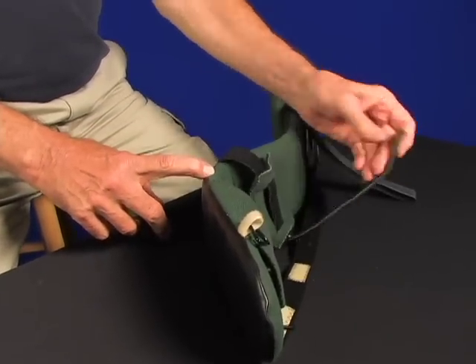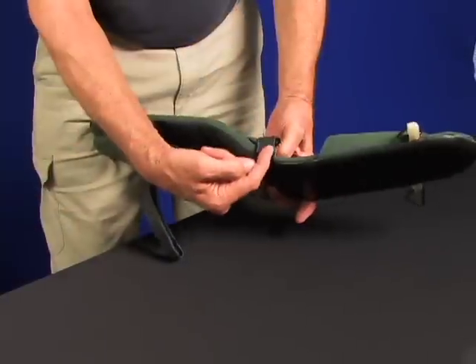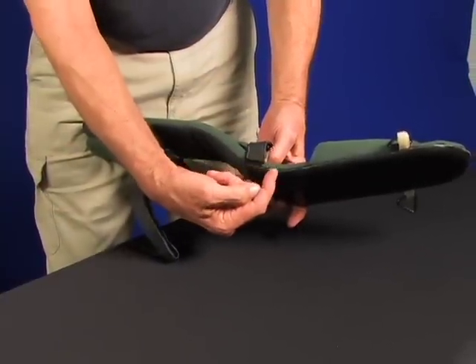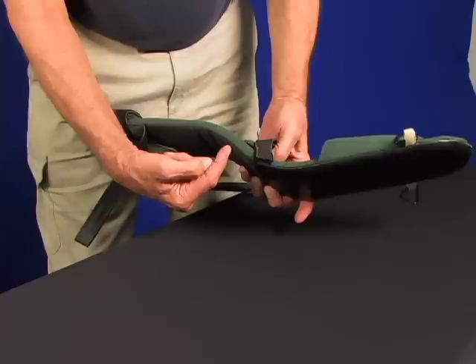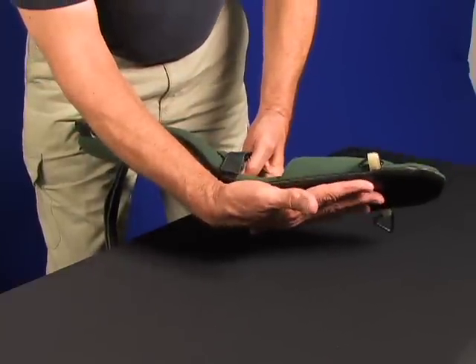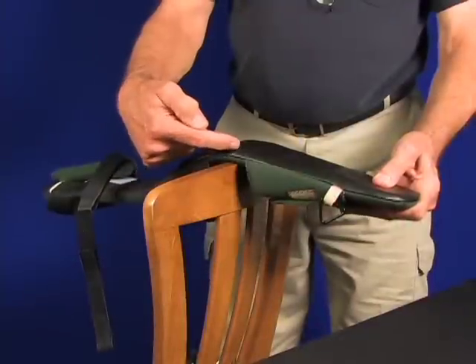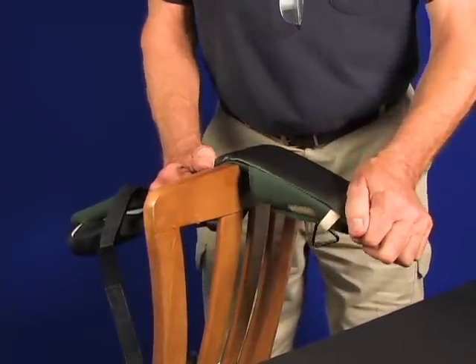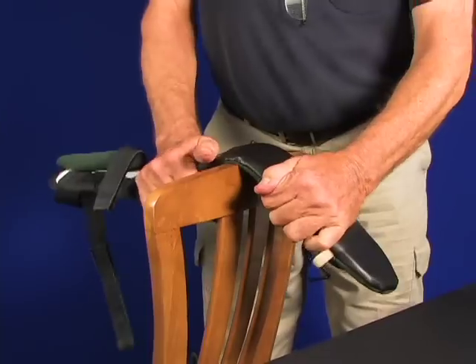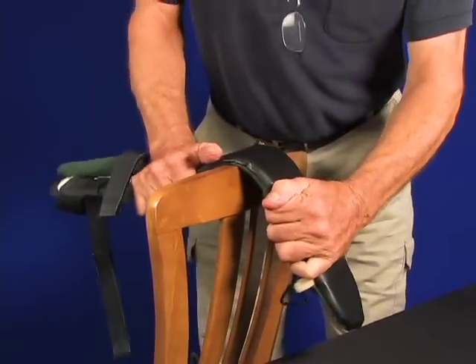It's helpful to fold the Velcro straps back on themselves to keep them out of the way. By shifting the heel bend location, you change the relative lengths of the foot and calf. If you move the heel curve towards the foot, it's going to shorten the foot length. And vice versa, if you move the heel bend up toward the calf, it will make the foot longer.